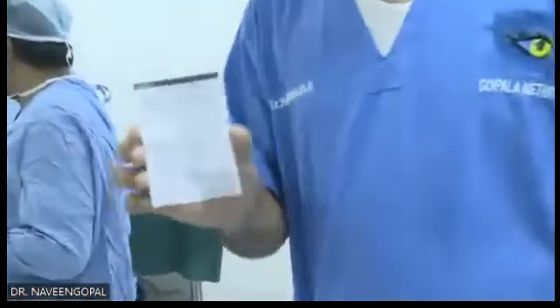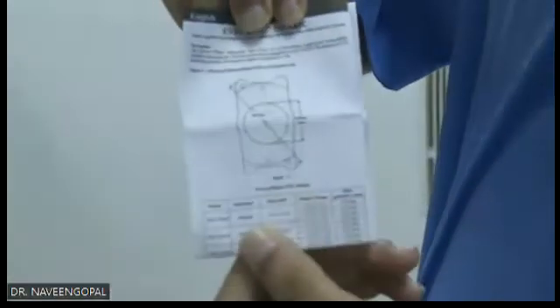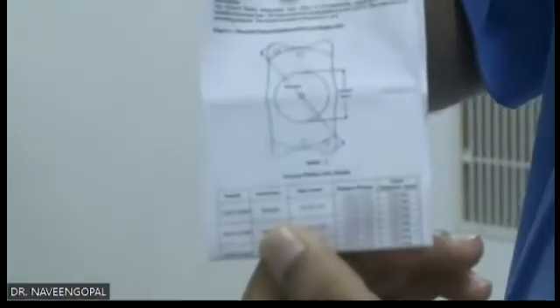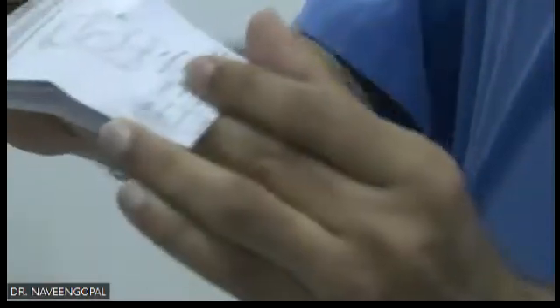See here, you can see the leading haptic hole, which is towards the left side, and this is a trailing haptic where it is towards the right side. So always make sure that your phakic IOL is oriented in such a way, and there will be a curvature when you place an ICL while loading. You can see the curvature, convex surface on the top. So it has to be loaded in such a way that the leading haptic will be towards the left side.